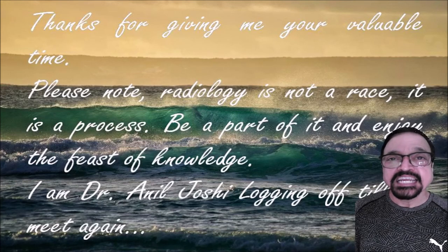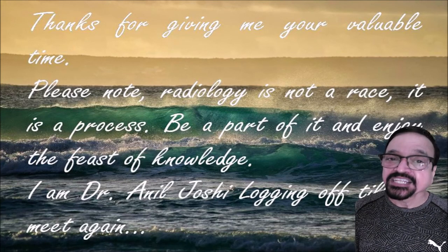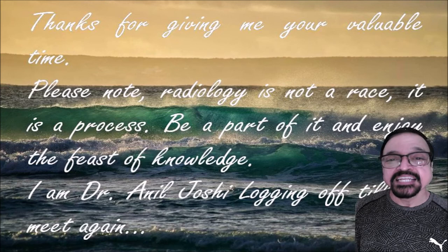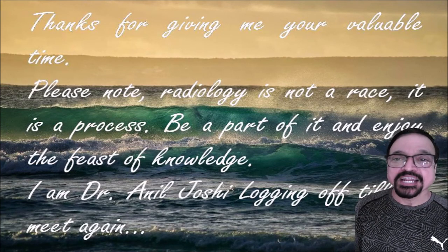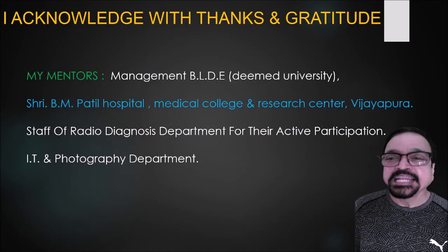After seeing that referral letter, a clinician has to analyze which anatomical structure he is looking for. He has to adjust to the patient's clinical condition. The patient may be in agony, may not be cooperative, may be irritable. With all these things, he will have to find out what exactly is required from that patient so that a good diagnosis will give him a speedy recovery.